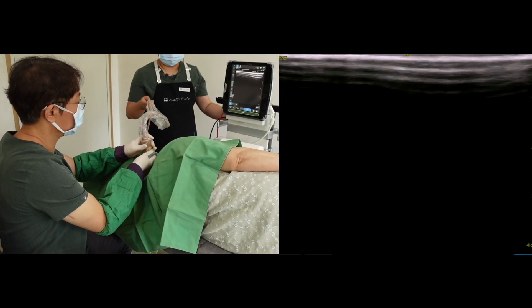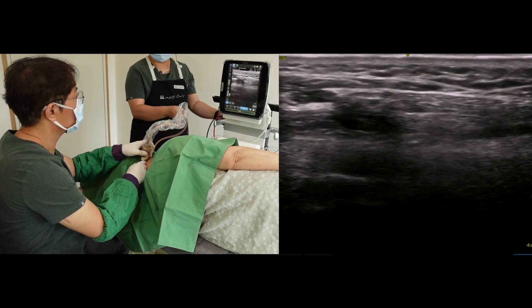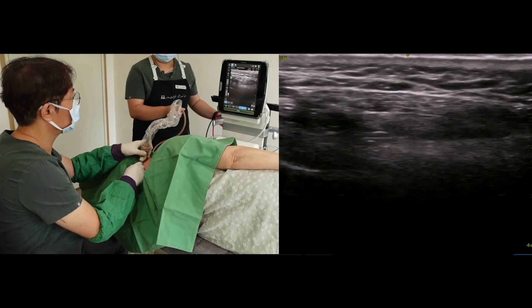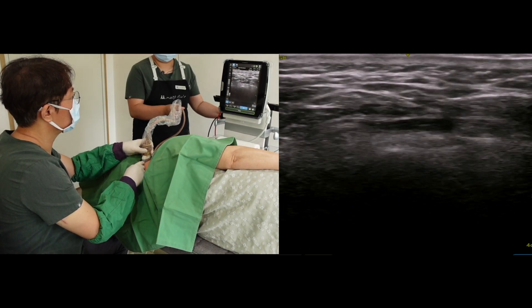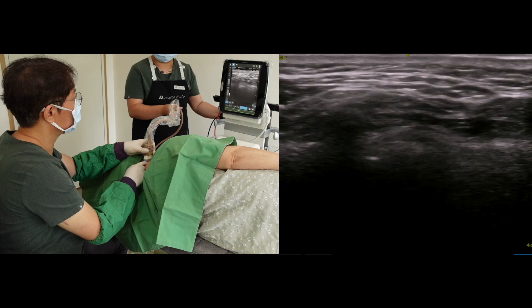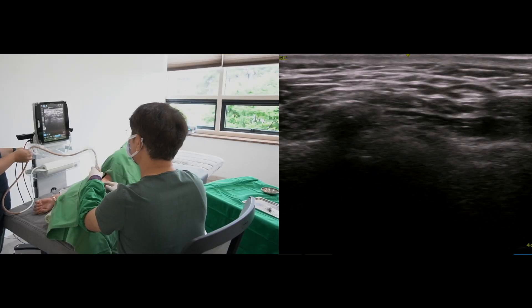I prefer the transverse in-plane technique. It is easier and quicker than a longitudinal scan with an out-of-plane approach. Let's watch the transverse scan along the lateral neck, focusing on the facet joint and articular pillar line.